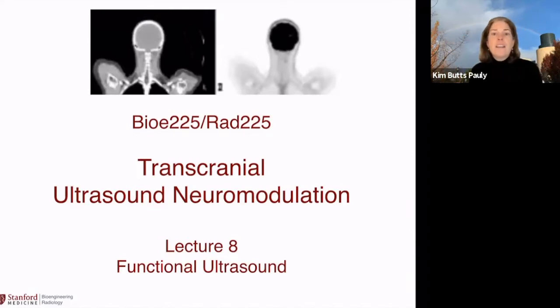On the right is a PET picture, and there, the darker it is, the more metabolism there is. So this is most likely an FDG PET, and FDG is fluorodeoxyglucose. Wherever glucose goes, the FDG goes, and there the FDG has radioactive decay, and the radioactivity is picked up and traced back, and you get an image of where that radioactivity came from. In other words, you're seeing where the glucose is, or the metabolism. And the point of this picture, we'll talk about in just a moment.